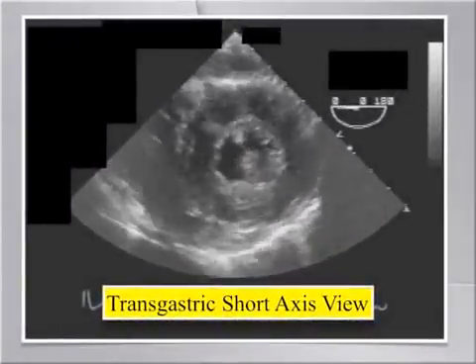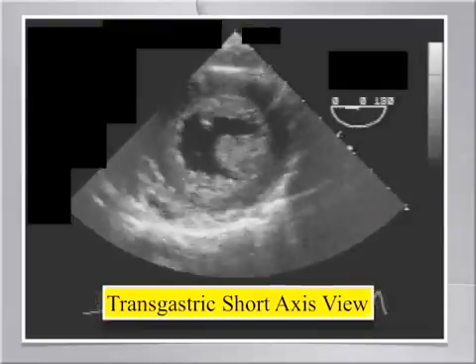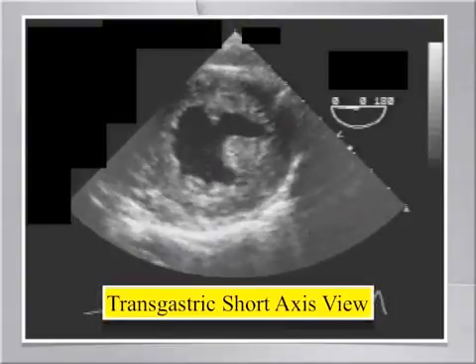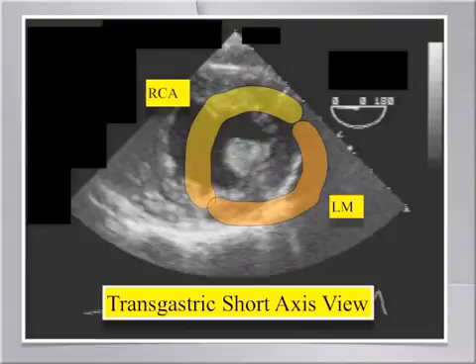We spend a significant amount of time looking at ventricular function in the mid-papillary transgastric short-axis view. One advantage of this view is that it shows the distribution of both left and right coronary arteries in the same image, and is thus extremely helpful in initial assessment of ventricular function. While a popular starting point, it is by no means the only view or method for assessing ventricular systolic performance.